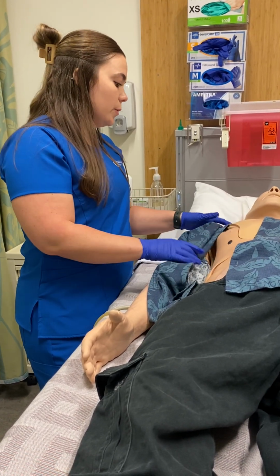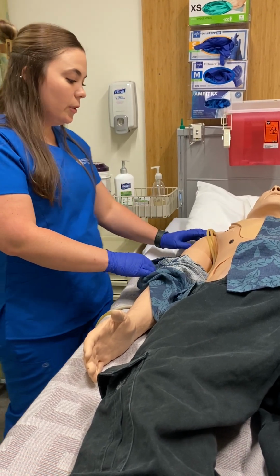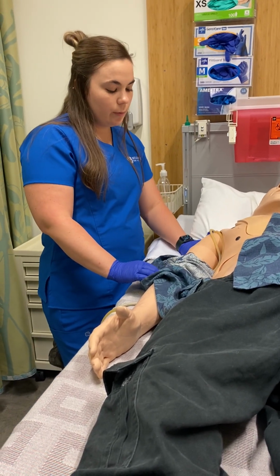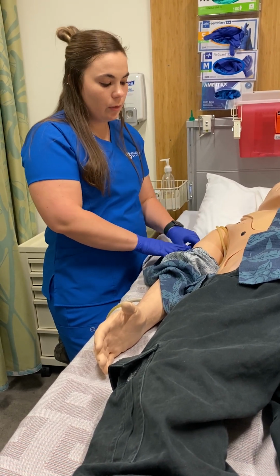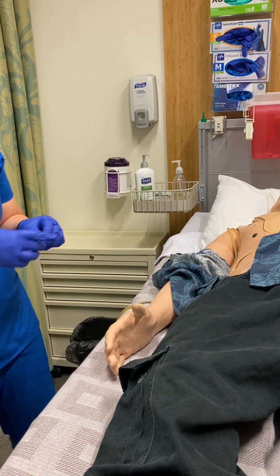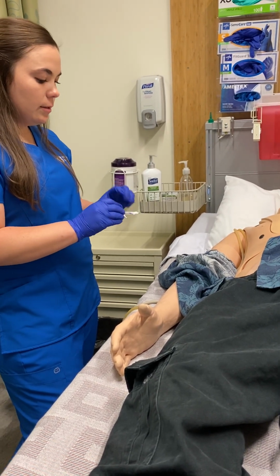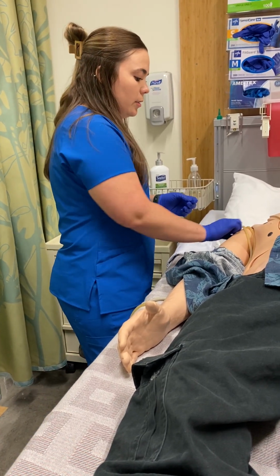So I'm just going to expose you a little bit so I can get to your arm. To locate the deltoid, you would go 2 finger breadths below the acromion process and use the axillary crease to form a triangle, and you would go right in the middle of that. We would cleanse the site using an antimicrobial agent.